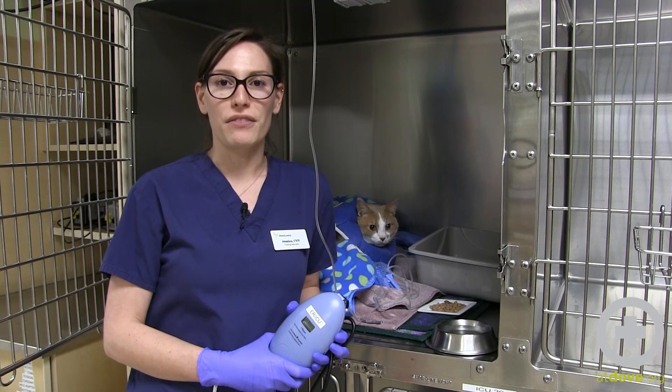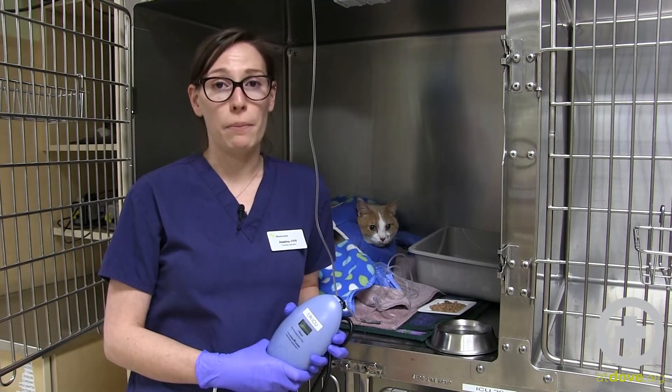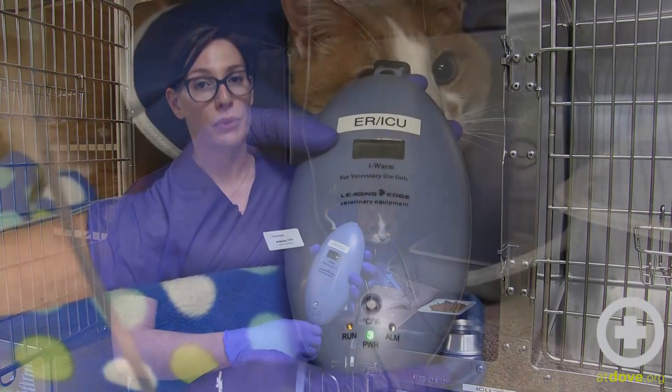Hi, I'm Jessica, and I'm one of the technicians here at Dove Lewis, and I'm here to talk to you today about patient warming, but more specifically, patient IV fluid warming.